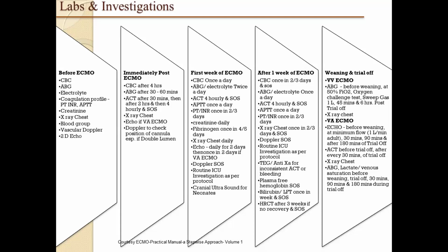To the extent that sometimes blood gases are done on an hourly basis to make sure that things are okay. ACTs are checked every 2 to 4 hours. So these investigations need to be spaced out as time goes on, depending upon the requirement of the patient, because cost of treatment also goes up significantly because of all those interventions that we are doing, the requirement of blood products. Some of these patients are on CRRT, so we need to have a judicious way of planning the blood investigations for these patients.